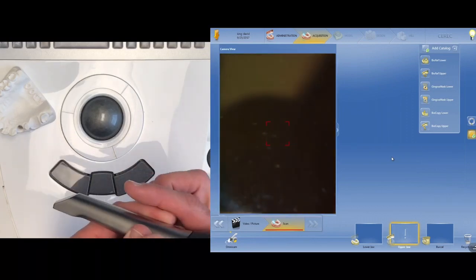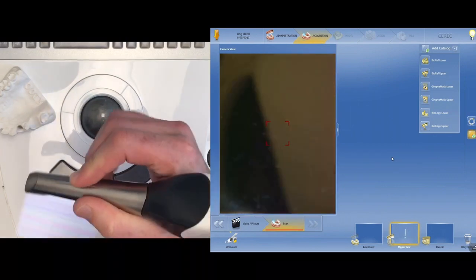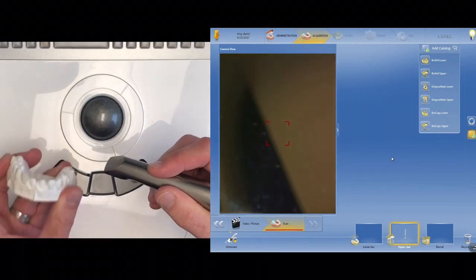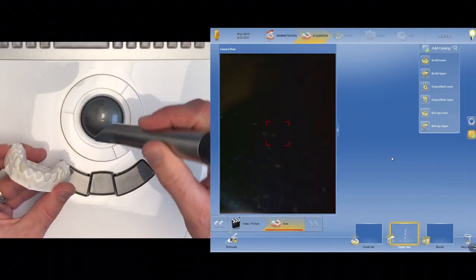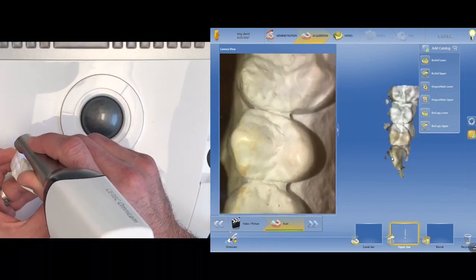So let's go ahead and I'll show you how I hold it. I hold it just like I hold a handpiece. I find that this works really well. The weight is resting on my hand here. And then when I position it in the patient's mouth, let's say for instance this is the patient's mouth, and I'm right-handed, so I'm going to approach from the right side. I always want to have a fulcrum, so I'll hit the fulcrum right here, and then I'm going to scan.